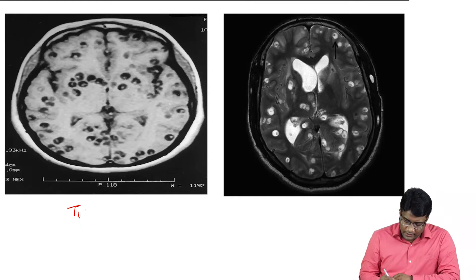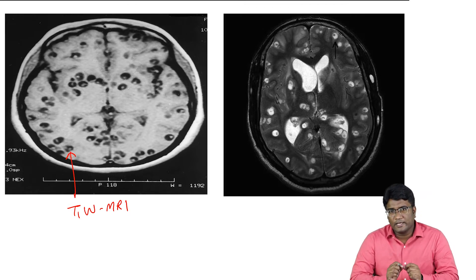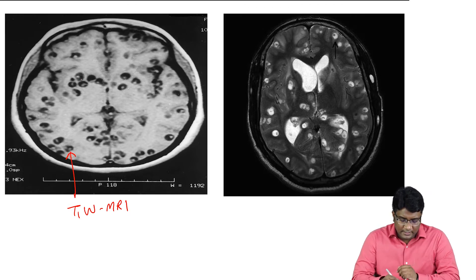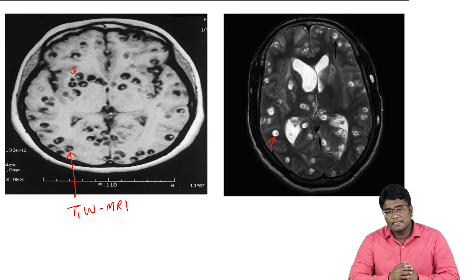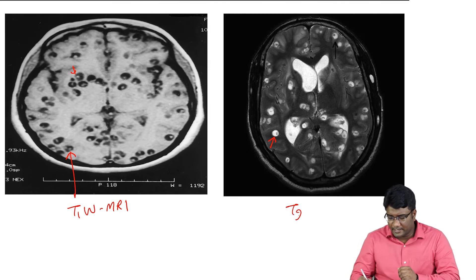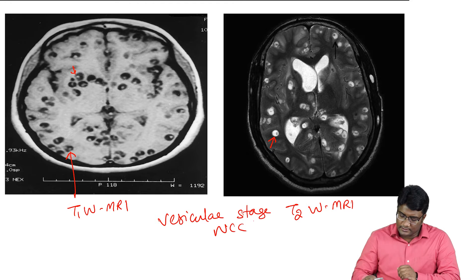This is a T1-weighted MRI showing cystic lesions with a central scolex. On T2-weighted MRI, the cystic lesions appear white, while on T1 they appear dark. The cystic areas show a hypointense scolex on T2-weighted MRI. This is how you see the vesicular stage of neurocysticercosis — a cyst with a central scolex.